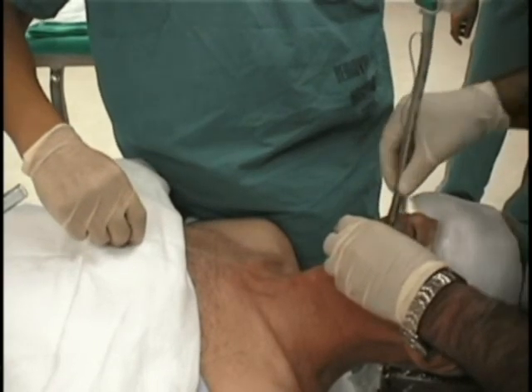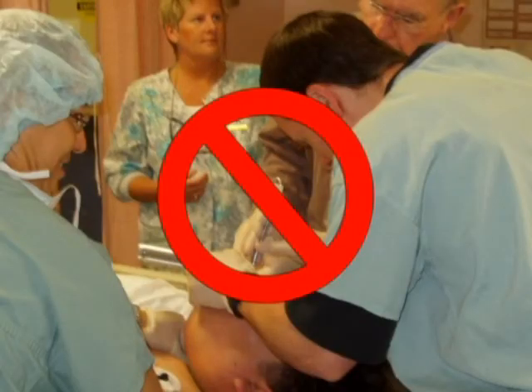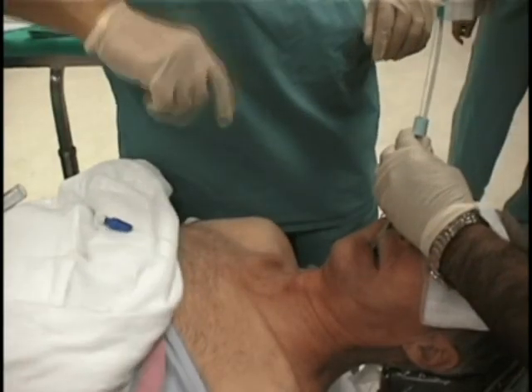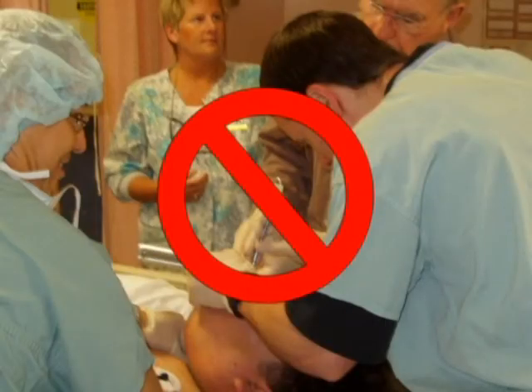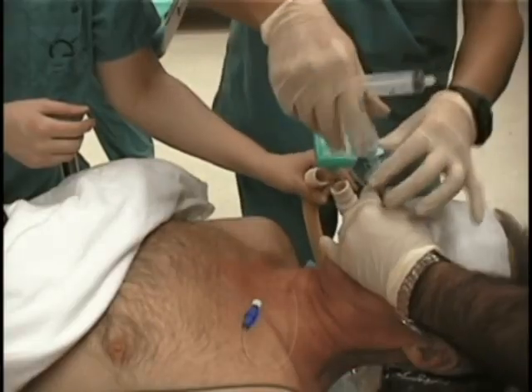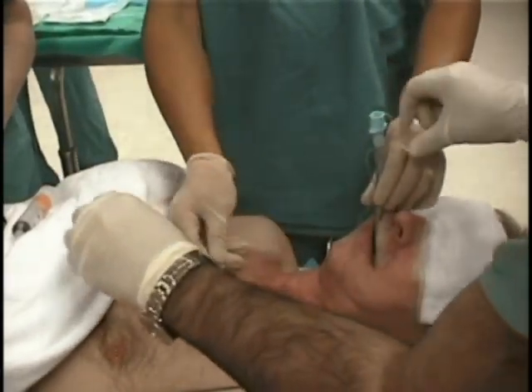In summary, the retrograde intubation technique has been shown to be an effective and safe procedure for placing the tracheal tube in patients with a predicted difficult airway, or perhaps in the cannot intubate but can ventilate failed airway. Unless one has extensive experience with the technique and is confident it can be performed very quickly, it is not a rescue technique to be considered in the cannot intubate, cannot ventilate failed airway. With proper patient selection and preparation, this technique can be a valuable adjunct in the management of a difficult airway in patients awake or under general anesthesia.